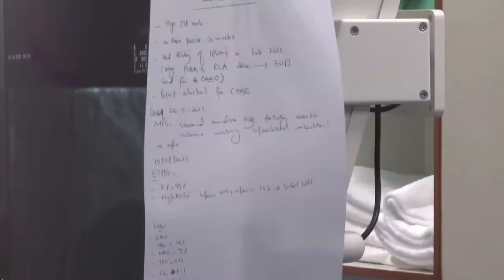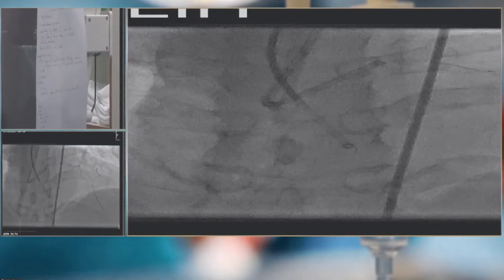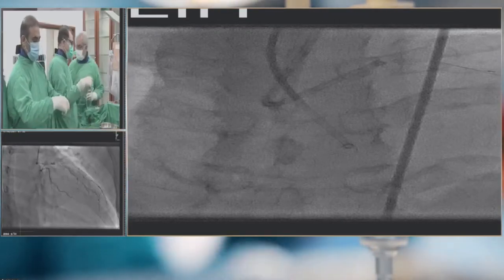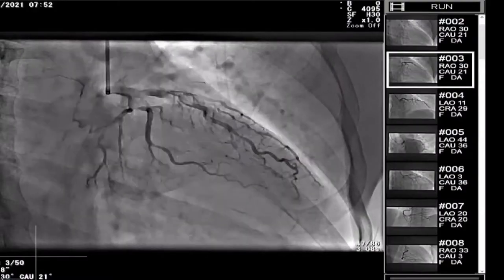This is the LAD-CTO. Can you show us the angiogram, the baseline angiograms, please? Okay, where will we play the baseline angiogram? The images you took today would be fine. Sohail, the basic shots from today, if you can just show us those, that would be great. Can we show the first angiogram? So let's show them the initial procedure also, if you can.